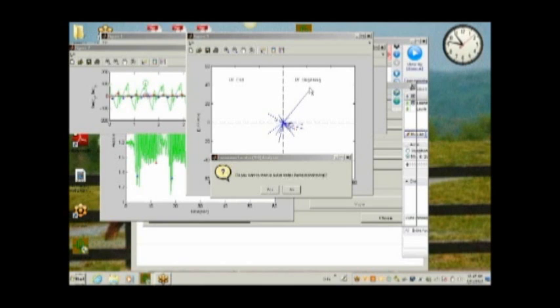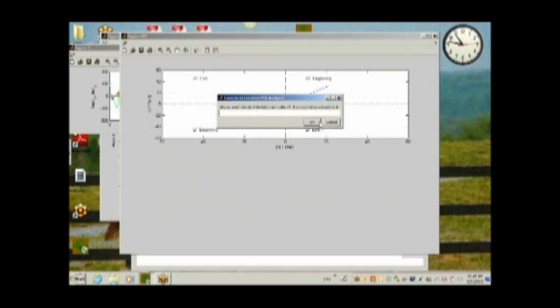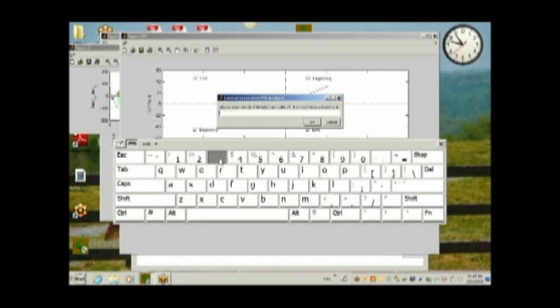The user is prompted to answer above what standard deviation are considered outliers. The default selection is 100 standard deviations from the mean, which effectively does not throw anything away. A conservative estimate is 4 standard deviations from the mean, which will not discard very many strides except in the case of extreme head tossing. You can begin with 3 or 4 to see if the desired strides are removed. In this case, we will enter 3.